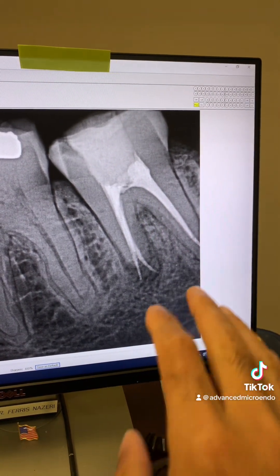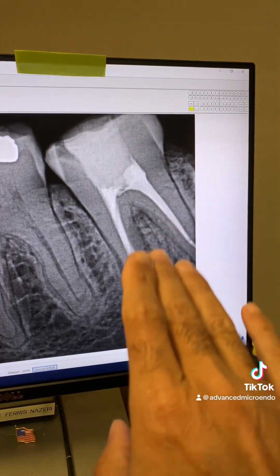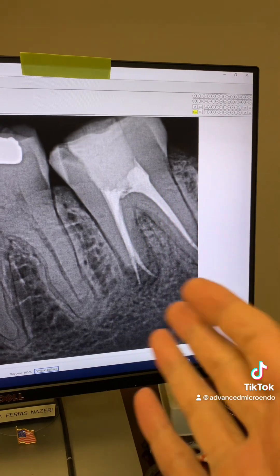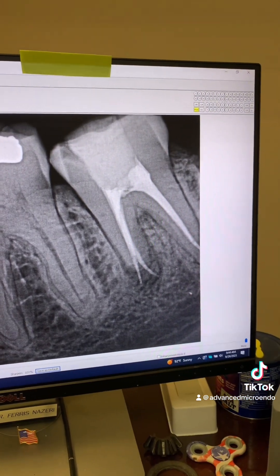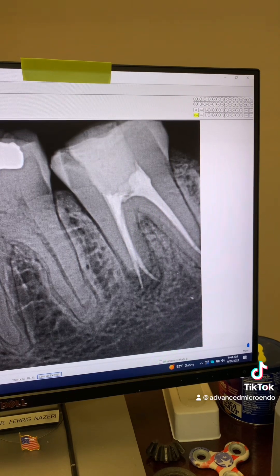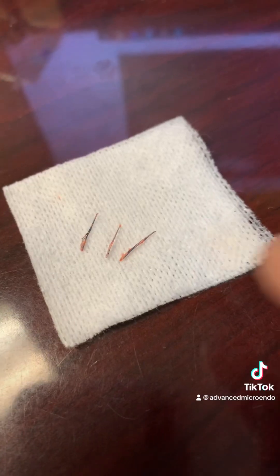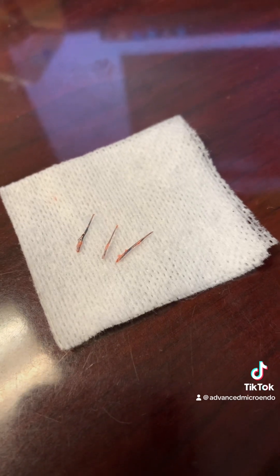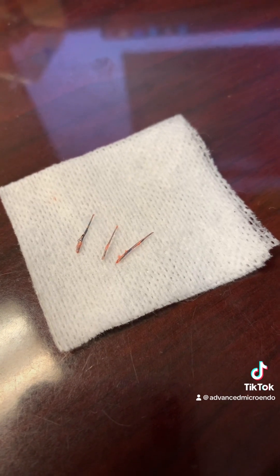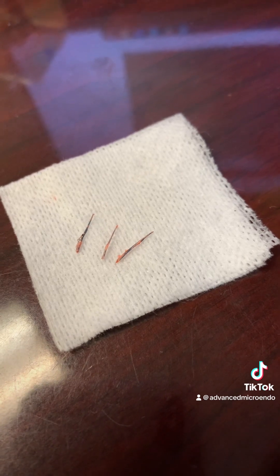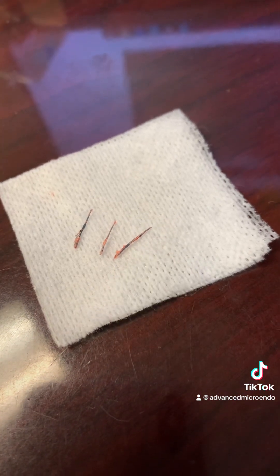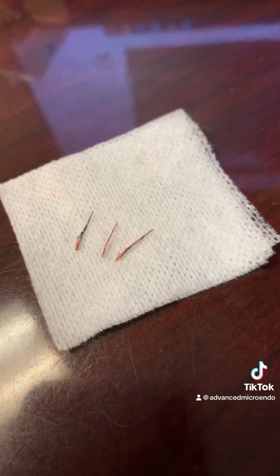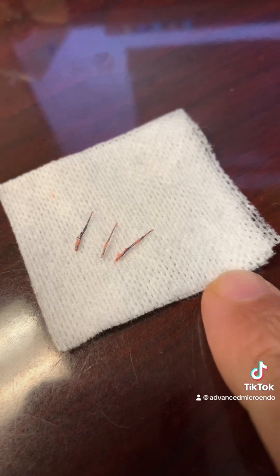We went ahead and discussed options with the patient — try to see if we can save the tooth by redoing the root canal with a guarded prognosis, or the alternative would be to extract the tooth. The patient is young; she said no, she wanted to try to save the tooth. These are the plastic thermofil carriers — as some endodontists call it, thermofil — that I removed from within the canals.